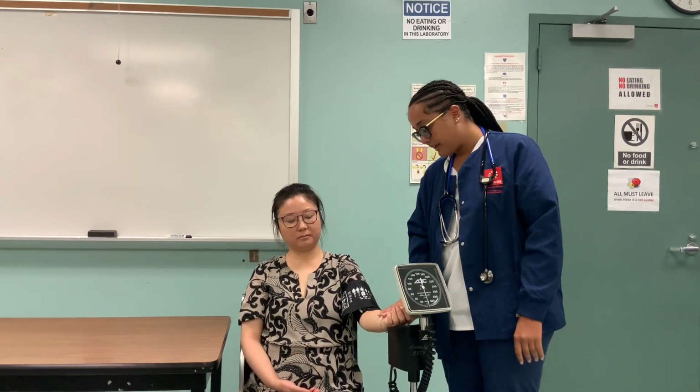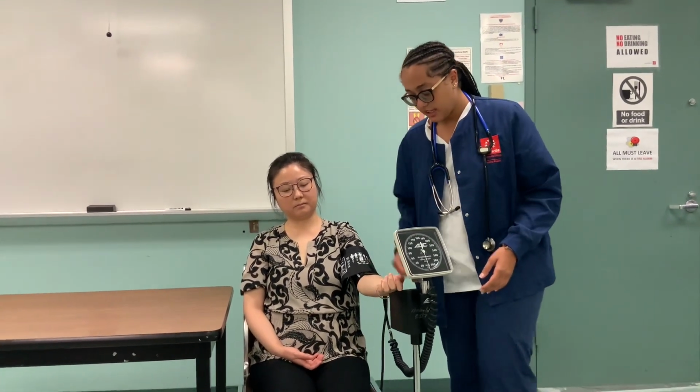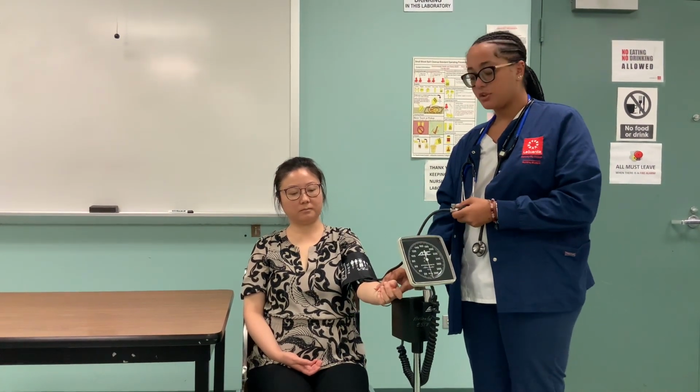And then you wanna palpate. You can either palpate the radial artery or the brachial. I like to use the radial only because it's a little more comfortable. And then you would be holding your bulb and tightening the knob clockwise. And you would be palpating. And you want to make sure that you feel the pulse. And then you would be pumping it until you no longer feel it while looking at the values. So you could estimate the systolic.